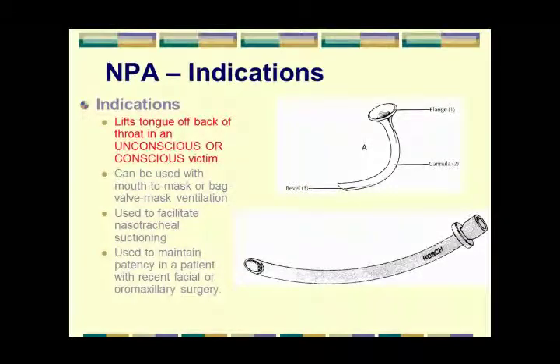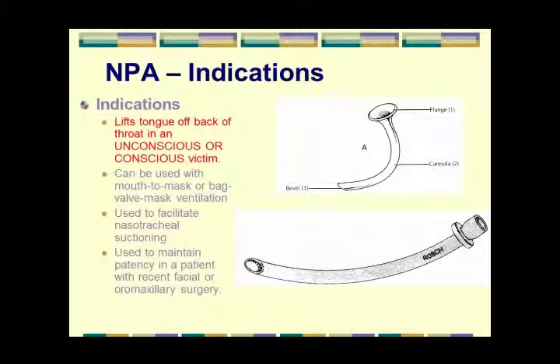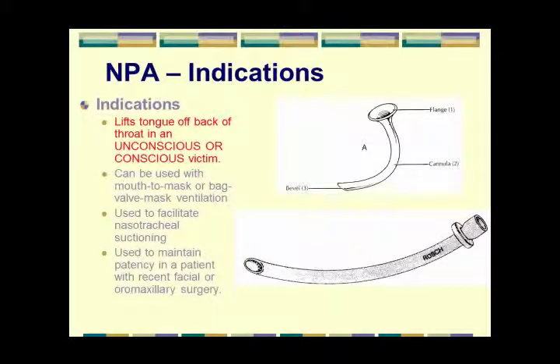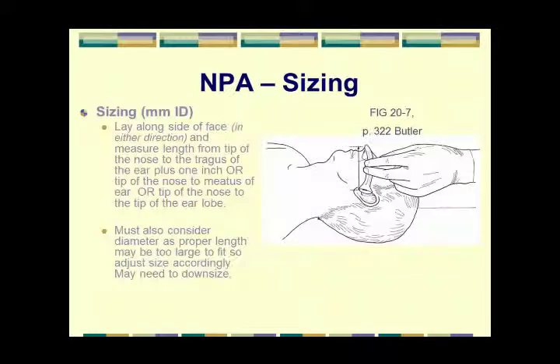We talked about nasotracheal suctioning. And we talked about oral maxillary surgery. Okay, so those are the indications for why we would use a nasal airway over an oral pharyngeal airway. And gee, that might make a nice test question.